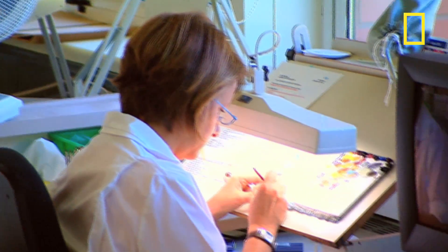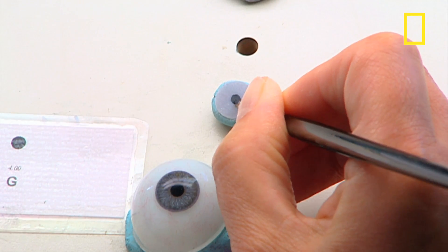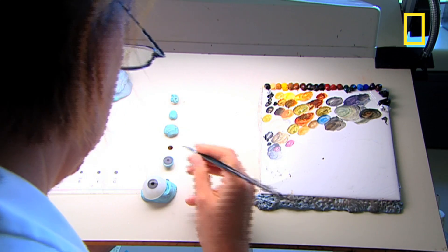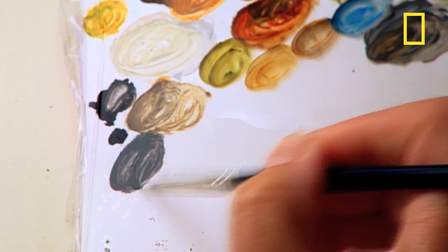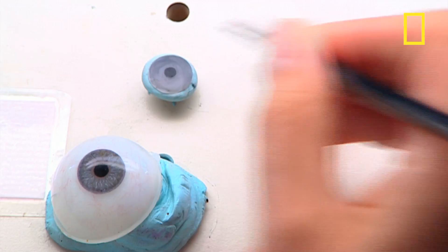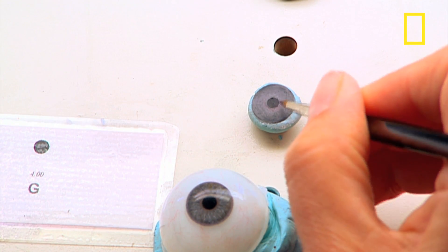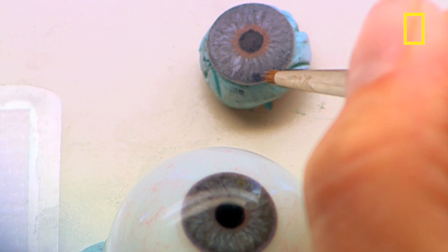The iris, or colored part of the eye, is painted onto a flat plastic disc which is measured to the size of the patient's remaining iris. Each iris is hand-painted using oil-based paints and the technicians work from either a digital photo or a previously painted eye to make sure that it will match the other eye.